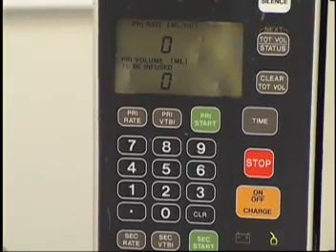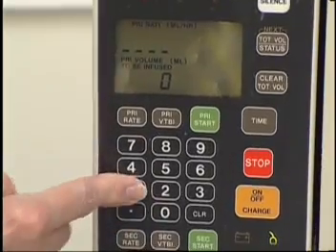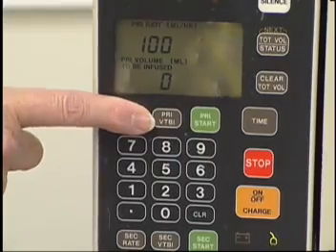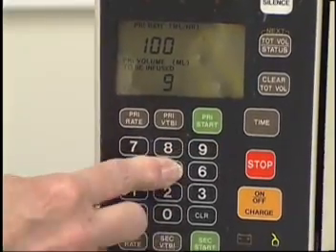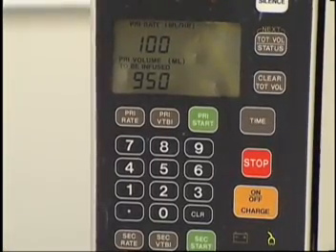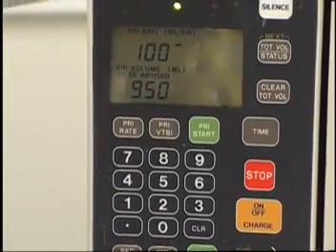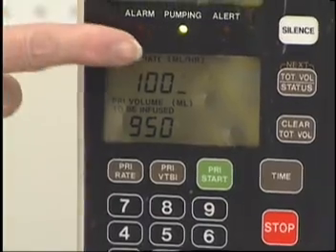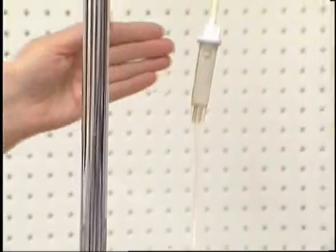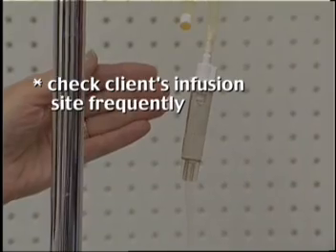Parameters include primary infusion rate, primary volume to be infused, start device when parameters are set. Observe that infusion is running properly. Check client's infusion site frequently.